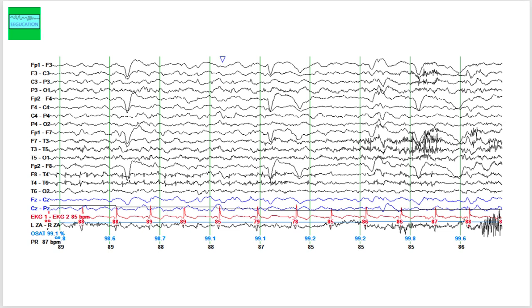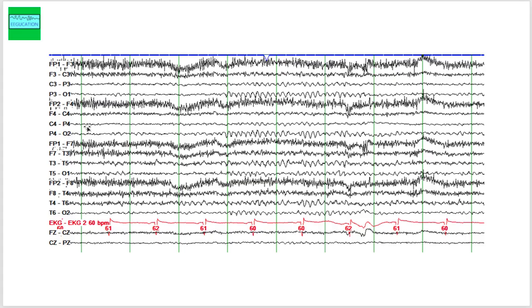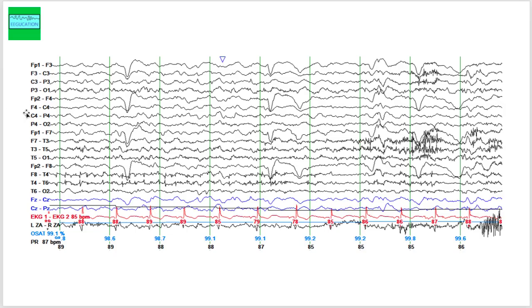Let me show you what a normal posterior dominant alpha rhythm looks like from another patient. If you look at P3O1 or P4O2, you see alpha frequency that is not seen anteriorly. In the frontal head region you see muscle artifact and some beta activity, while more posteriorly you see an alpha rhythm — that is the posterior dominant alpha rhythm. Coming back to our patient, we do not see a posterior dominant alpha rhythm.